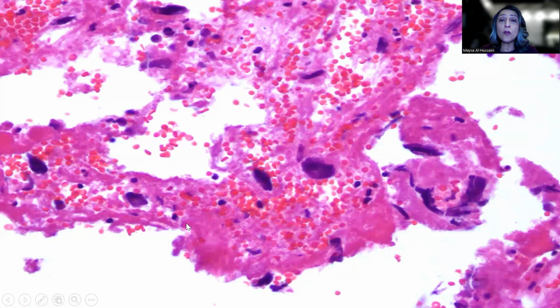And this is another focus where we have large areas of necrosis, and then those scattered large cells dispersed in the hemorrhagic/necrotic areas that we usually really don't pay much attention to, especially whenever we have a viable tissue.